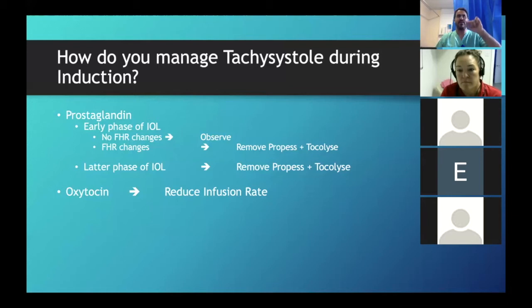It's fluctuating so minimally with a very high tone in between that once I gave her terbutaline, you could actually see the contractions. If you think the baseline has gone up because of hyperstimulation, it's not very common, but yes, it does happen. And I now know what you're talking about. But remember, that's the point when this is raised because it's a tetanically contracted uterus. There's a high tone all through, so the baby is not even getting proper cord compressions. It's just not getting enough oxygen, full stop.